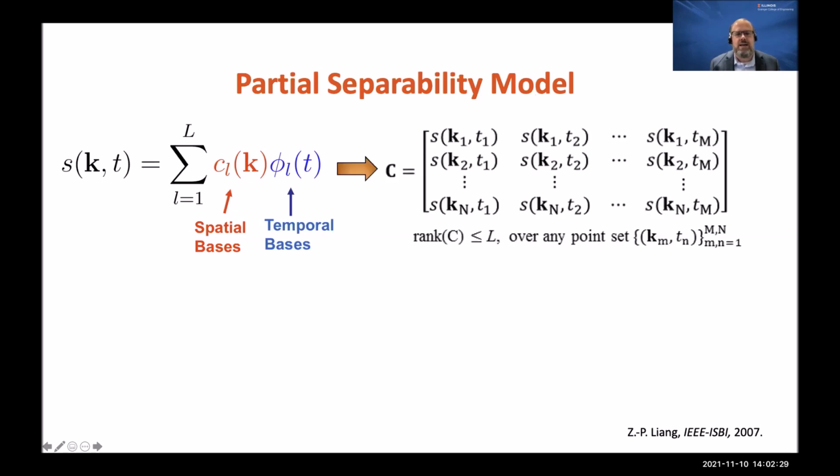What we would really like to have is a full data matrix. This data matrix has signal along the three-dimensional K-space on this axis, so fully sampled 3D K-space on this axis, and then this axis is time for that fourth dimension. And this is our full data matrix. This is called a Casorati matrix.